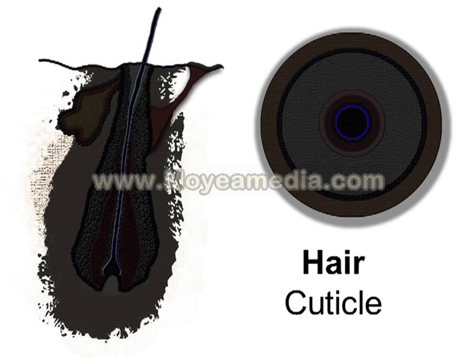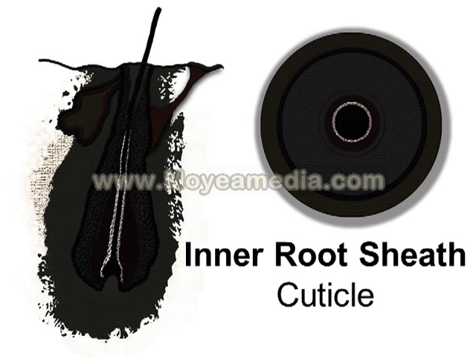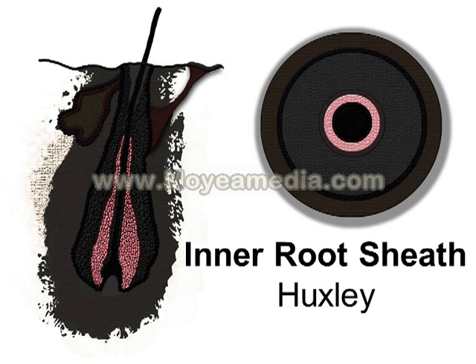And then the outer cuticle is composed again of a hard keratin that interdigitates with the cuticle of the inner root sheath, and that's what anchors your hairs in place. The inner root sheath is composed of 3 layers. The inner root sheath cuticle is the innermost layer. Next is the Huxley layer, which is the last to keratinize, and so usually easily visible because of the bright red trichohyalin granules within it.